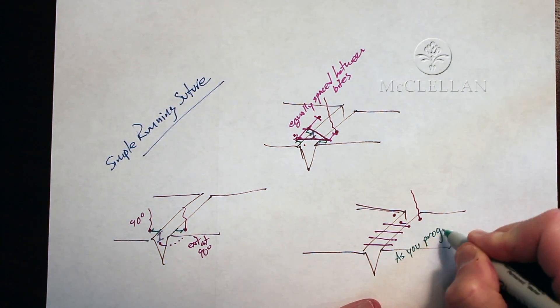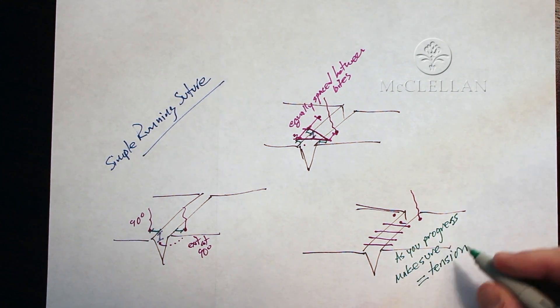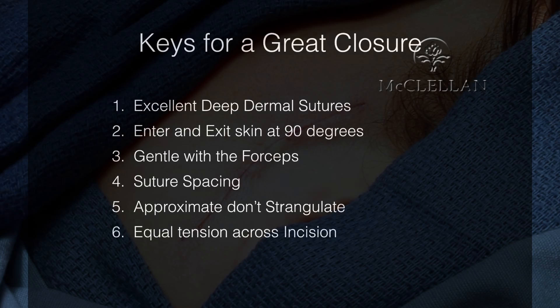As you've progressed down the wound, you want to make sure that you have equal tension on the sutures because they're going to want to loosen up, so you provide equal tension. The keys for a great closure are excellent deep dermal suturing, exiting and entering the skin at 90 degrees, being very gentle with the forceps — you should have no marks on the skin — proper suture spacing, approximating the skin without strangulating it, and equal tension across the incision.